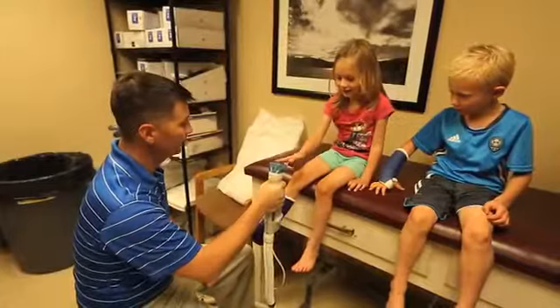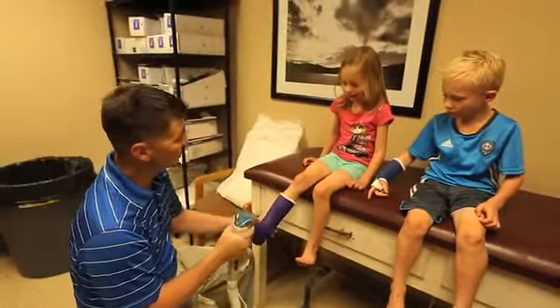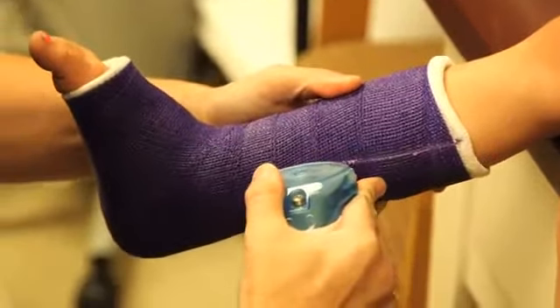Watch this — you want to touch it? I can't cut you, but it'll cut through this. There's no pain with getting the cast off. The blade is a reciprocating blade and it actually can't cut you.